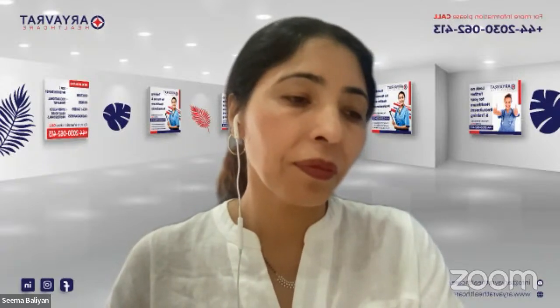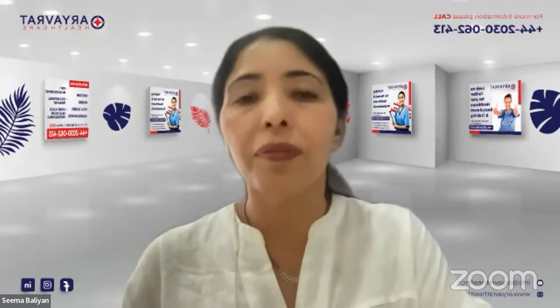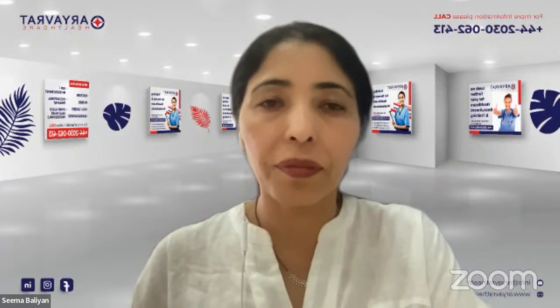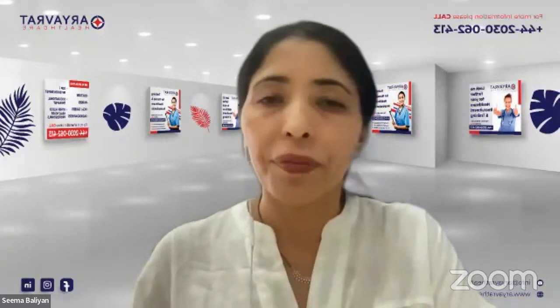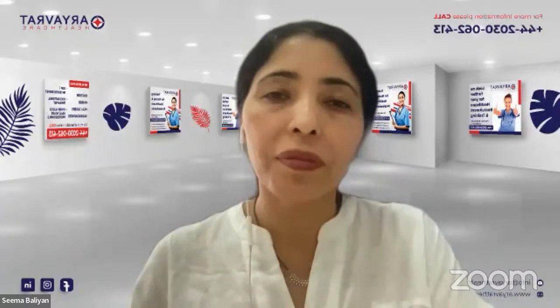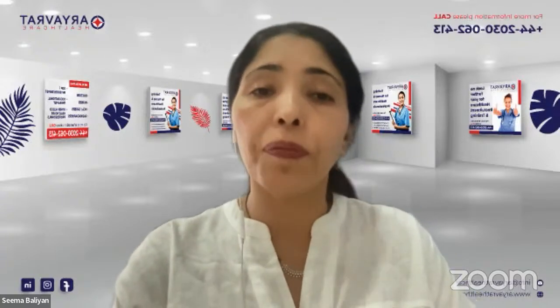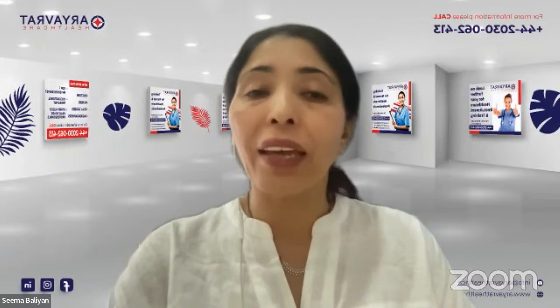Inhaler is the one kind of device which is used to administer medicine in an inhaled route. For example, salbutamol is one example of a medicine which is used in an inhaled route. So you are right that the inhaler is a device which helps us dispense the medication in an inhaled route.